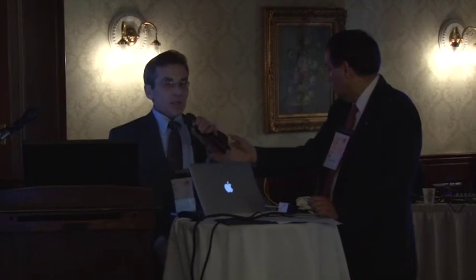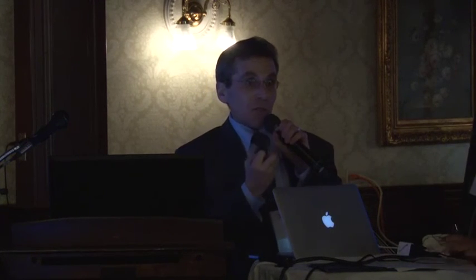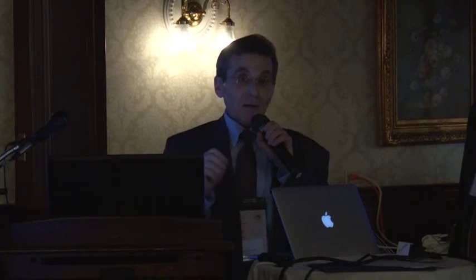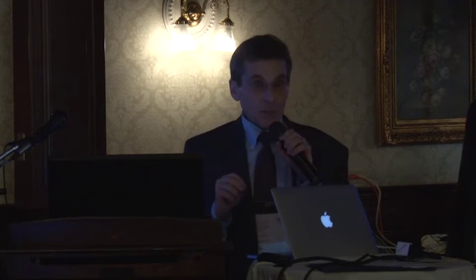The question is, have you looked at anti-PDGF with OCT angiogram? So right now, the theory behind platelet-derived growth factor inhibitors is that you're going to prevent the growth of the neovascularization, and you might actually get regression of the neovascularization. Currently, OCT angiography is not part of the ongoing phase 3 studies.